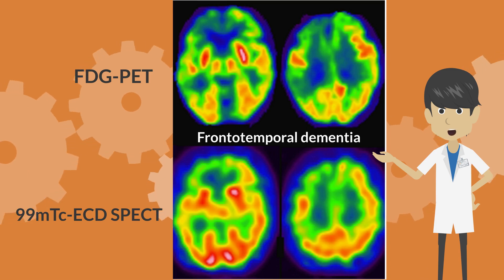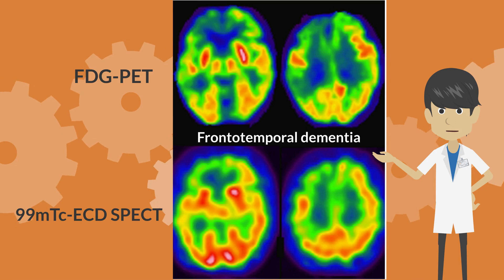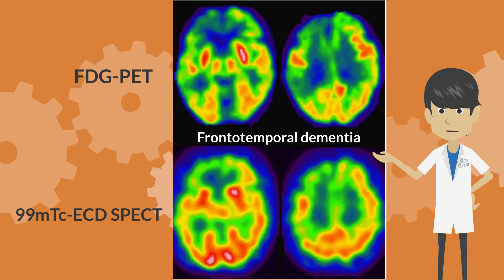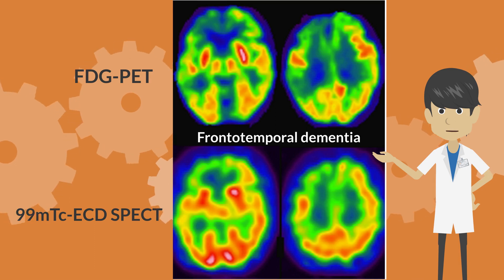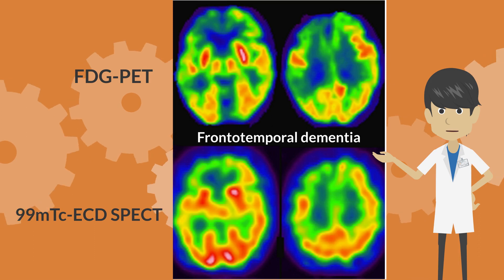As you can see, glucose metabolism PET provides clearer images than brain perfusion SPECT, but similar findings can be obtained with brain perfusion SPECT.